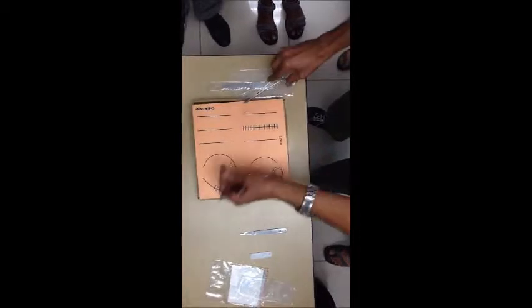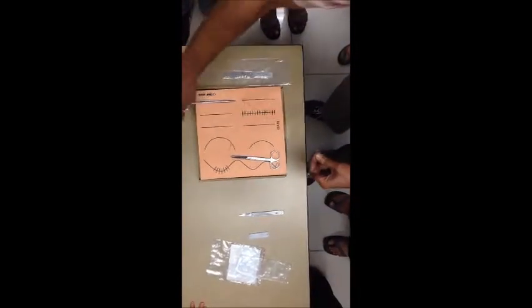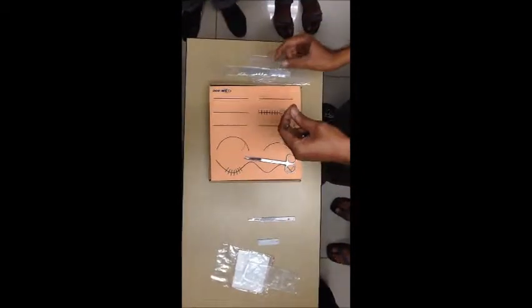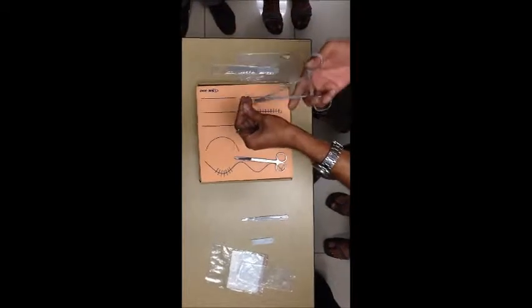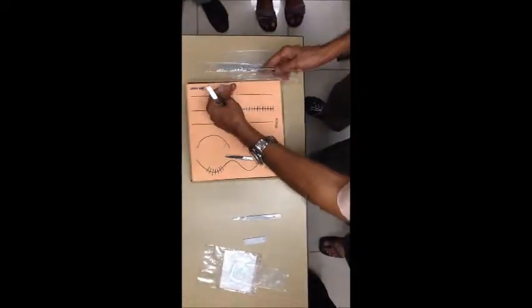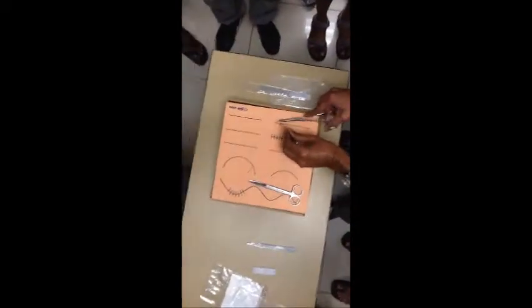After you've taken multiple throws and firmly embedded the knot, in actual practice, the end which I'm holding now, we just put an artery forceps on like this and put it to one side. But now I can't because I don't have an artery forceps. The assistant should give constant traction on this end so that it doesn't become loose. Since there's no assistant, I'll just do it myself. I'm going to lift it up like this and take another bite, full thickness, other side, full thickness, other side, and now I'm going to just continue.